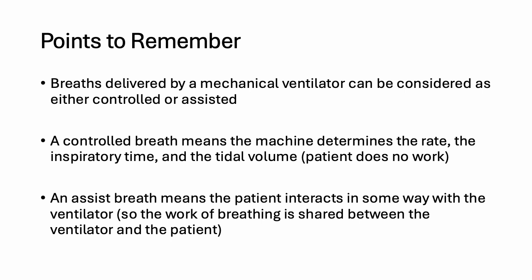Some points to remember before we move on. Machine breaths delivered by a mechanical ventilator can be controlled or assisted. It can also, of course, be spontaneous, but when I'm talking about breaths delivered by a mechanical ventilator, I'm referring to machine or mandatory breaths. It can be considered either controlled or assisted. Controlled breaths means everything is done by the machine. Patient does no work. An assisted breath is where some things are done by the machine, and most of the time it is just the triggering or the initiation of the breaths.